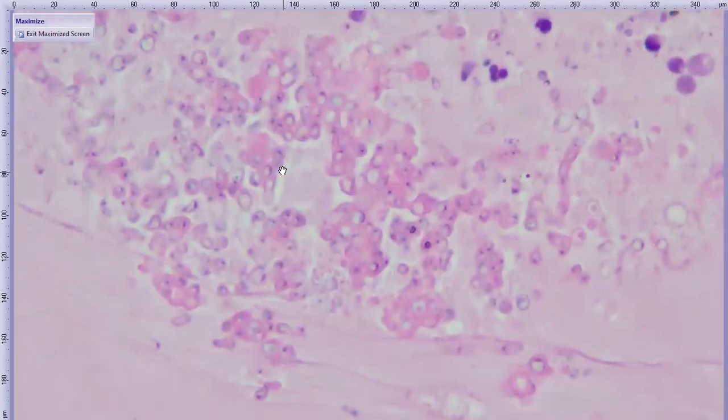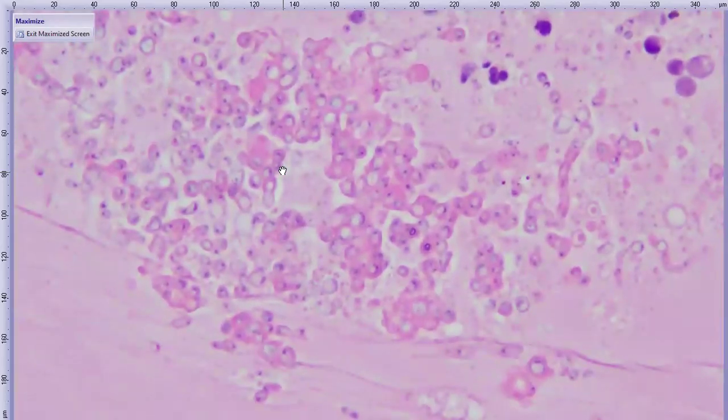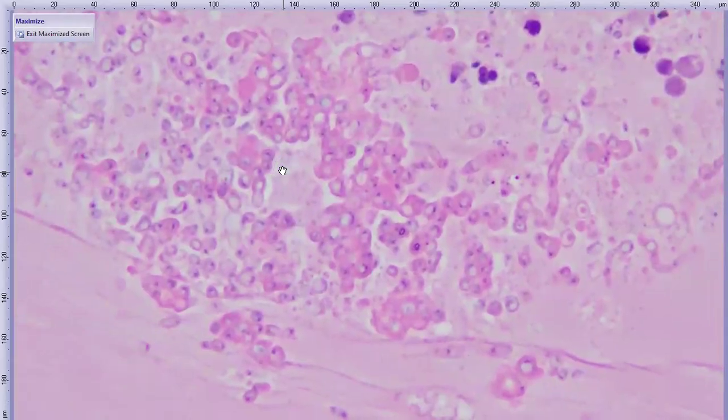Oh, I could go in closer, I suppose. And I could probably go in closer and stop for a bit because motoring around doesn't really help. All right, there it is. So that's really interesting. And you might wonder, we are going to skip to the other eye really quick if we found any of those similar organisms in the other eye. Because I will say that if we do see fungus inside an eye, it is possible to get a local extension from a local anatomic structure. Unlikely when there isn't a lot of orbital disease. It is possible to get contaminated penetrating trauma, and that's why you get fungus in your eye. There's no evidence of trauma necessarily in our sections.